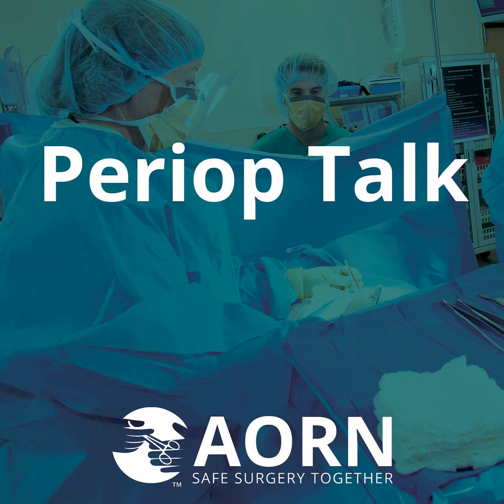And you've talked a lot about quality, and when I think about quality, I also think about patient outcomes. So can you talk about how these guidelines could potentially impact patient outcomes? Yeah, so the biggest issue here that I've been talking about that was a concern for us is those packaging defects. They can compromise the sterility of the package. All that work you did to make sure it was sterile, and you have a hole in your package or a gap in your seal and it's not sterile anymore. And so that puts the patient at risk for infection. That's the ultimate outcome that we're trying to reduce.